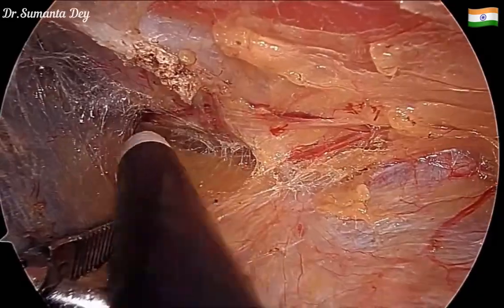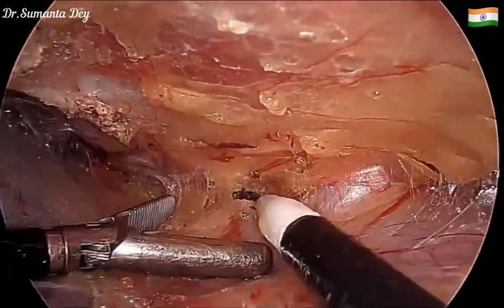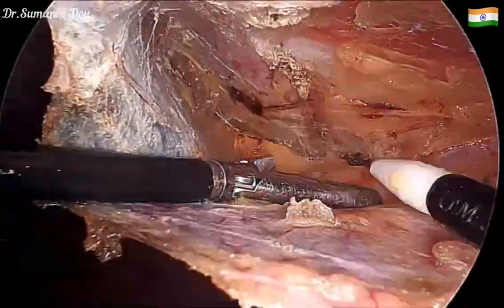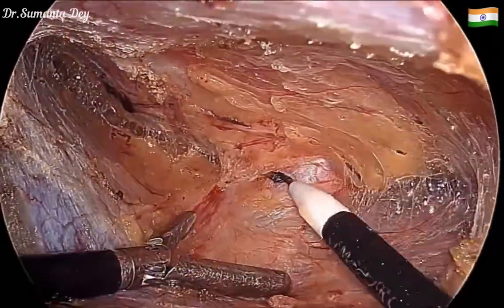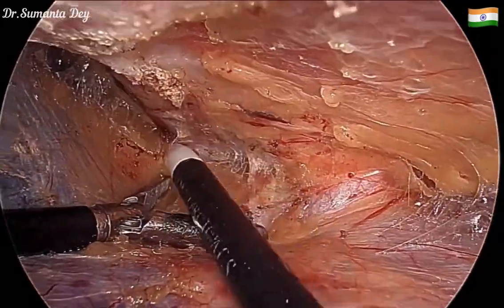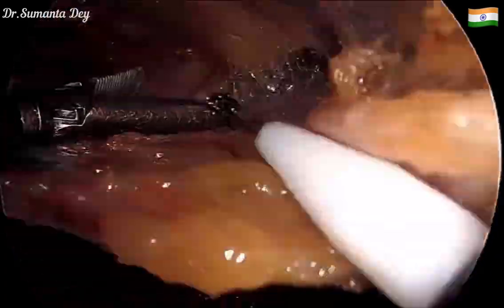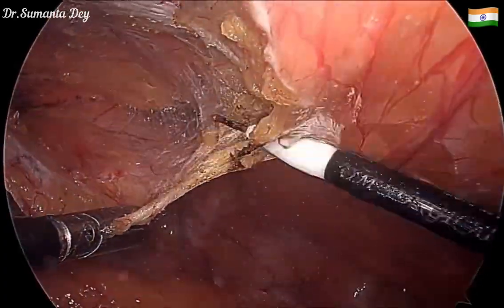Very gently, with a little bit of tissue dissection at a time, creating the plane further. The idea is to dissect at least 270 degrees all around the defect, and then try to reduce the sac. Before that, on both sides of the hernia defect, the peritoneum should be raised nicely.